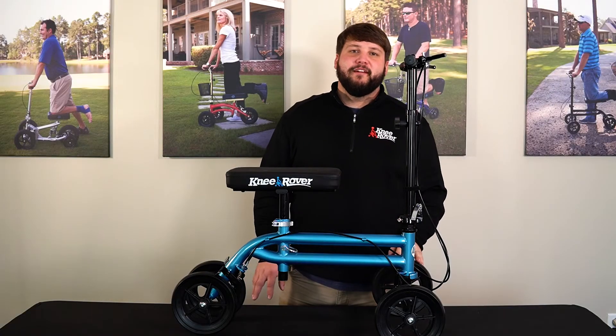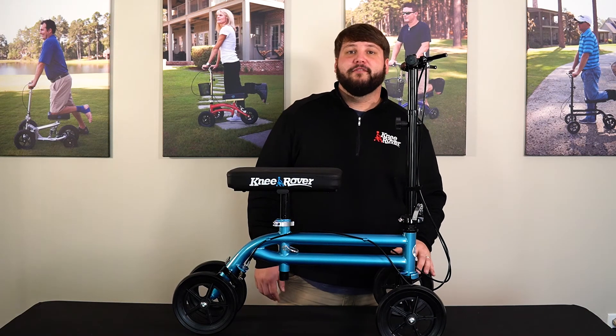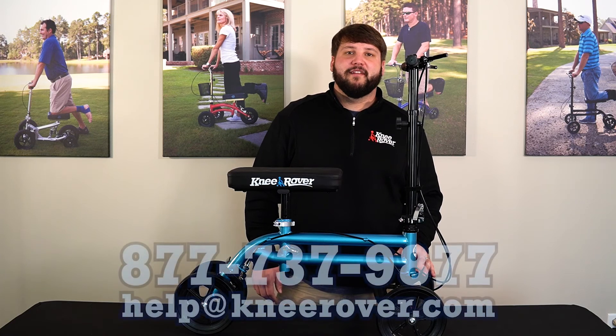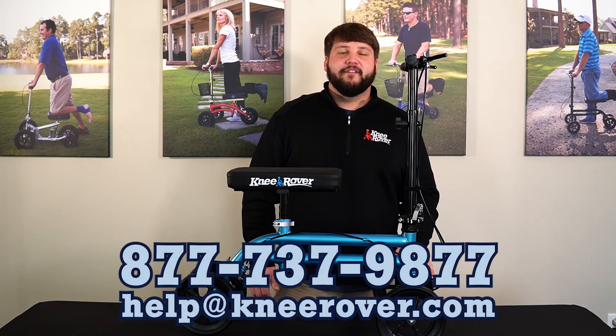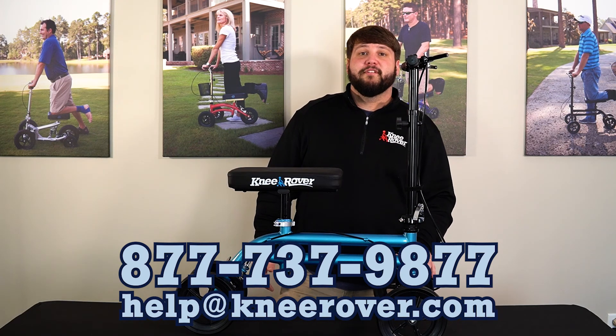That concludes the assembly of your Knee Rover Economy Knee Scooter. If you have any questions or comments, feel free to give us a call at 877-737-9877, or you can email us at help@kneerover.com. Thanks for choosing Knee Rover.